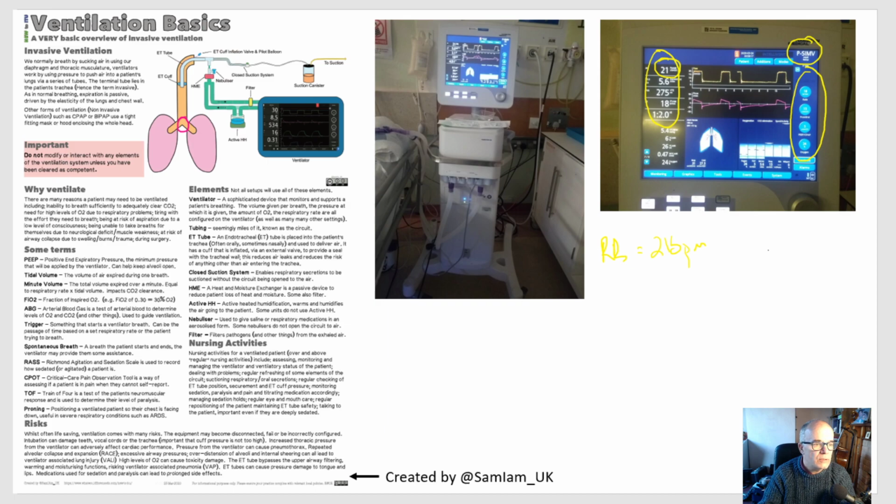I'm just going to rub out some of these lines because otherwise it's all going to get really busy. Okay, so that's the respiratory rate. That's one thing that we set, allowing the patient potentially to do some breathing for themselves, but on the whole, certainly when they're at their sickest, the machine will be doing most of the ventilating for them.